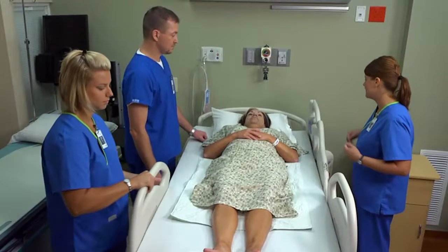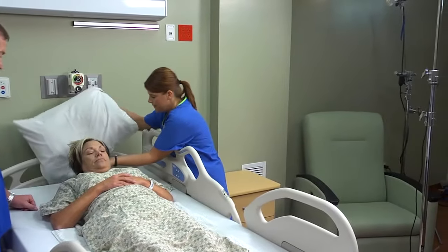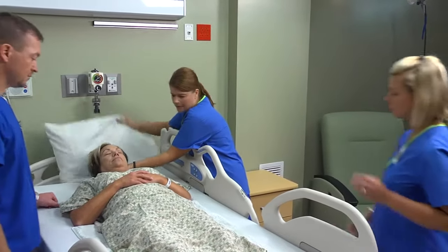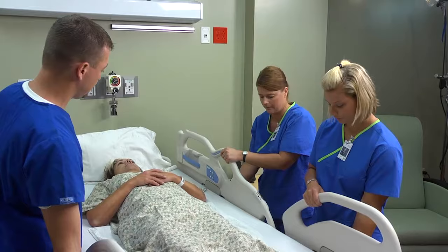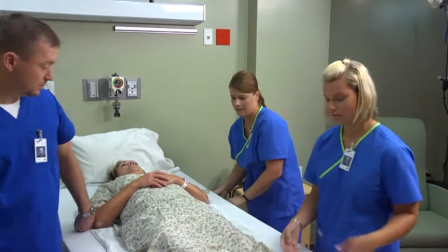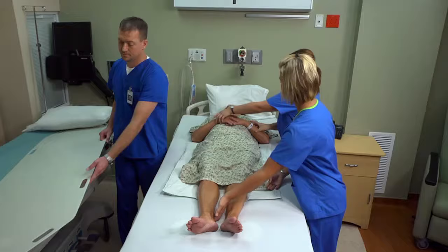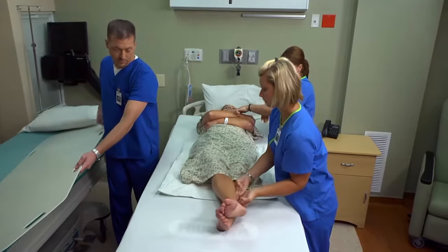Support the patient's head while you remove the pillow. Next, lower the side rails on the bed. Then cross the patient's arms over her chest and help her cross her ankles.